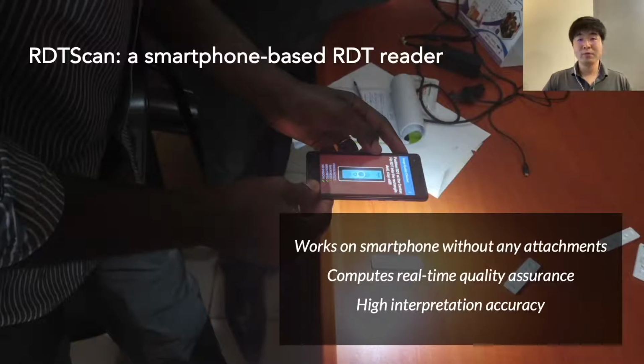To this end, we propose RDTScan, a smartphone-based RDT reader, since a smartphone is already ubiquitous in high-income settings and becoming more widely used in low-income settings as well. RDTScan should provide high-quality images without relying on additional attachments to the phone for wide deployability. To do so, RDTScan performs real-time quality assurance and guides users through taking high-quality images. And using the high-quality image, we aim for comparable interpretation accuracy to human experts.